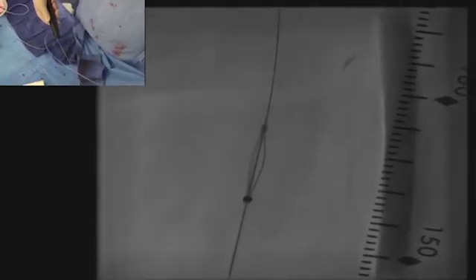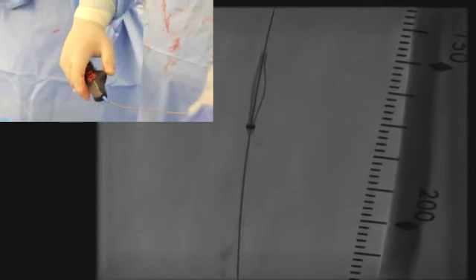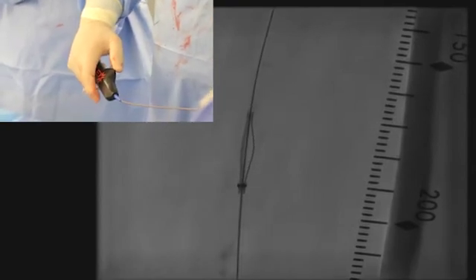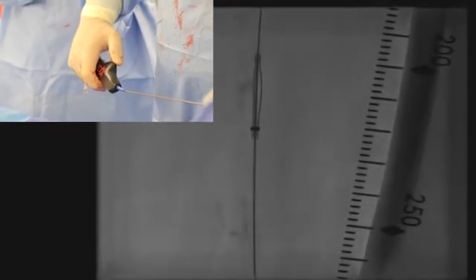What you are going to see here is that they are going to react to the vessel. Whenever they are going to meet high-grade stenosis, they might bend in a little bit, and then once they go through that, they are flexed out again.